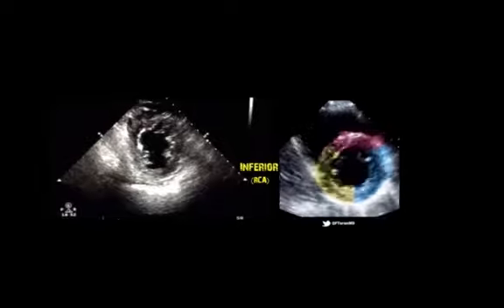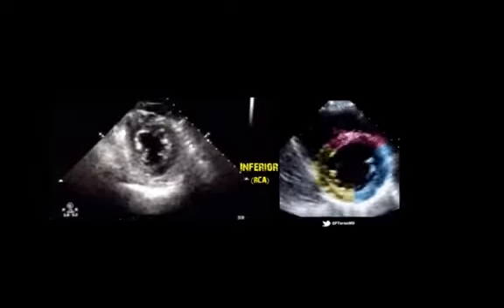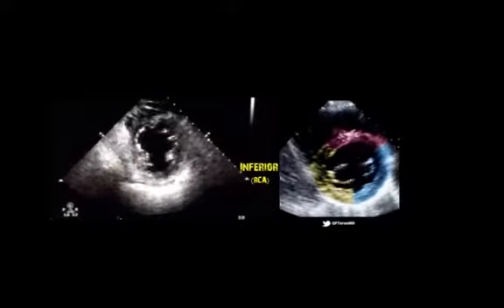What about our parasternal short axis? Where do we expect to see a regional wall motion abnormality here? Look to the inferior portion of the heart and slightly to the left, where the right side of the heart falls and where the RCA would feed to.